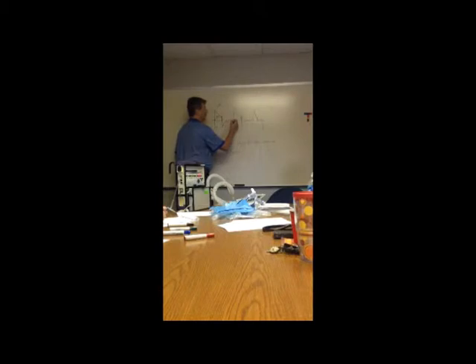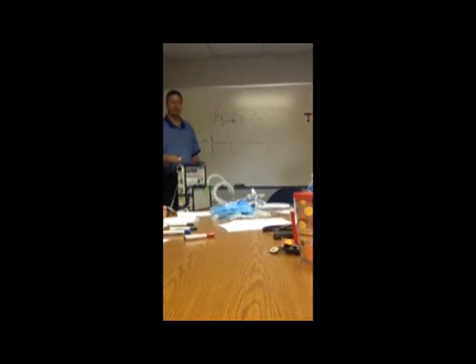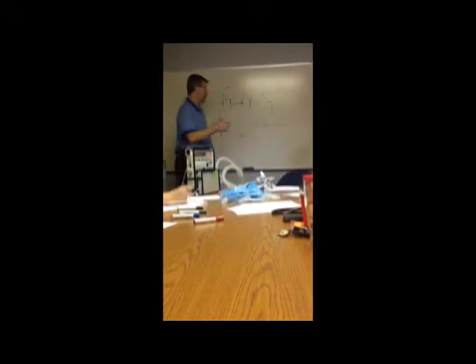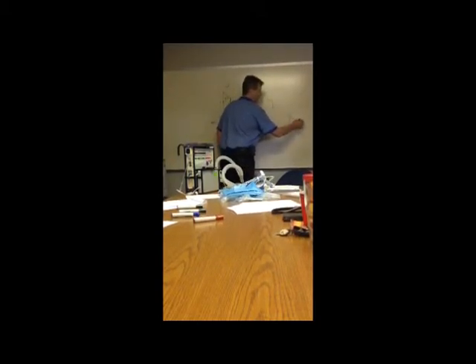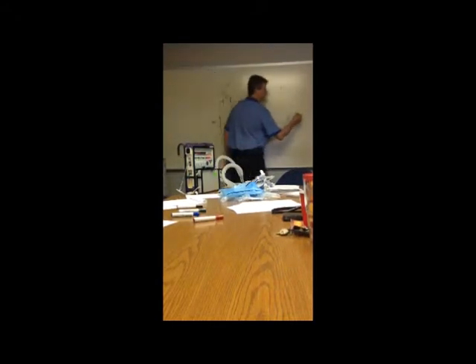What's different about it is when they breathe on their own, on assist control, they trigger the breath, they get a full machine breath. On IMV, which we now call SIMV, IMV is intermittent mandatory ventilation. We put the S in front of it because with computers and vents, they're smart enough now that at 7.5 seconds, it's going to give another breath no matter what happens. And we can kind of tweak the timing, but at 7.25, right before that next breath is supposed to be given, if the patient takes a breath, it counts that as the machine breath, and it gives them a full breath.